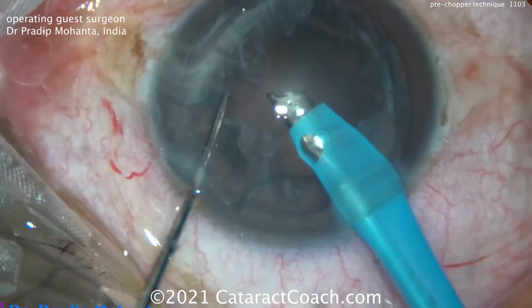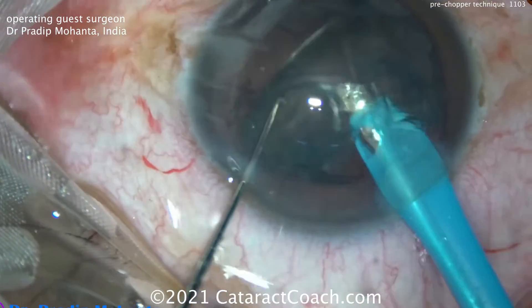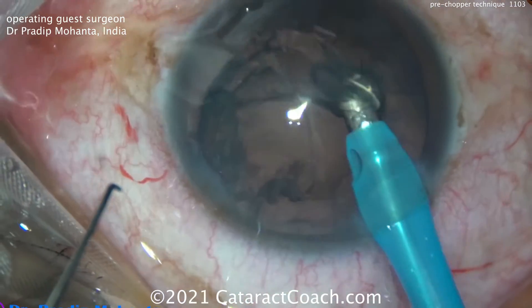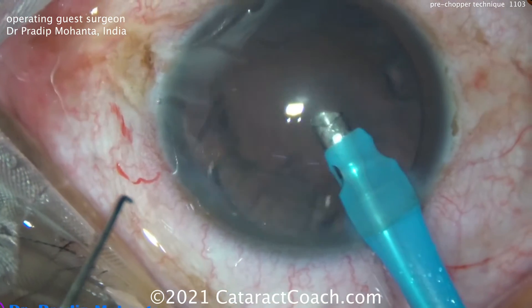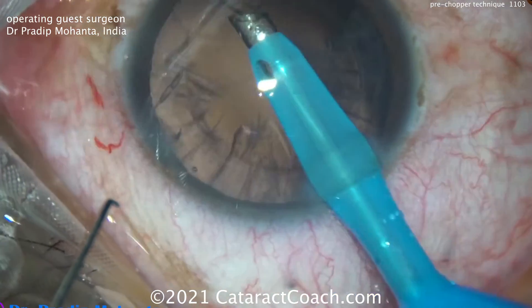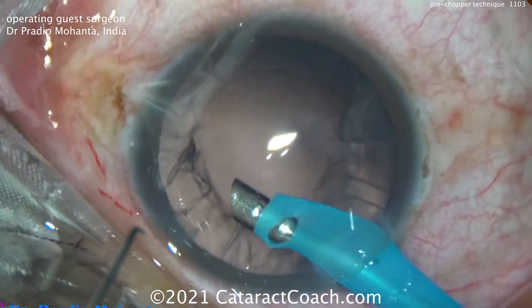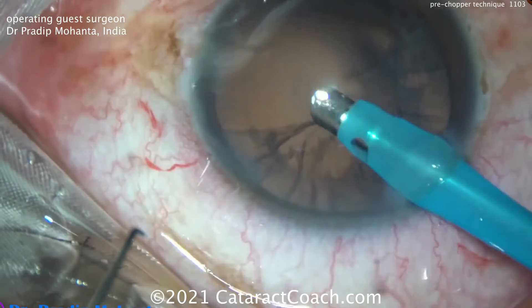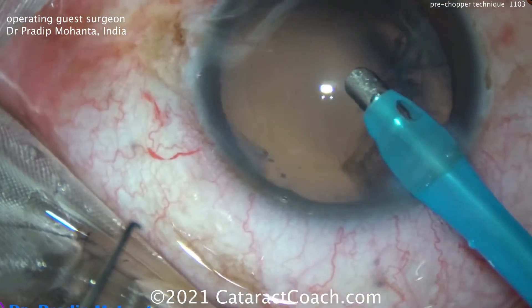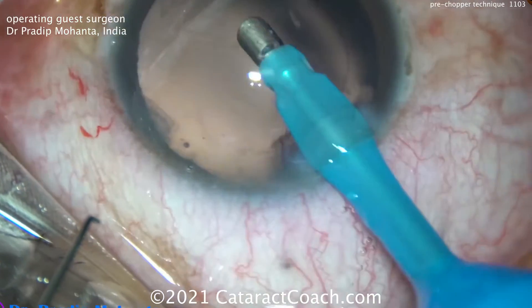We've seen the Akahoshi pre-chopper. We've seen using a femtosecond laser to divide the nucleus. We've seen Dr. Alex Abdo Martins from Brazil who simply uses the FACO probe on position one to hold the nucleus — with zero FACO power — splitting it by placement of his chopper directly opposite the probe. And I've even used, for a resident case, nothing more than a 27-gauge blunt cannula and a chopper to chop the cataract into small pieces so that my resident, just at the beginning stages, can learn to take the pieces out.